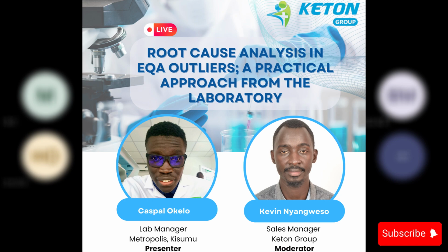Thank you. Sarati has asked, what is the interpretation for a passed EQA with a failed IQC? That would be an issue with your IQC, and I'm assuming your IQC is consistently failing. EQA gives us the accuracy. It means you are accurate, but you're not precise. IQC is a precision measure. EQA is an accuracy measure.